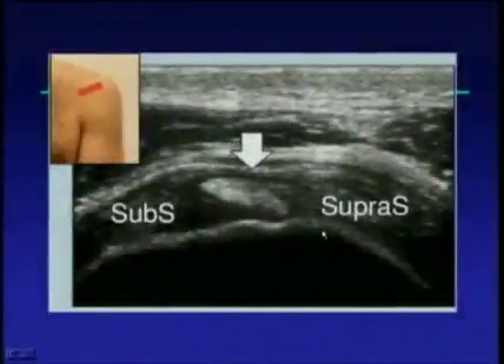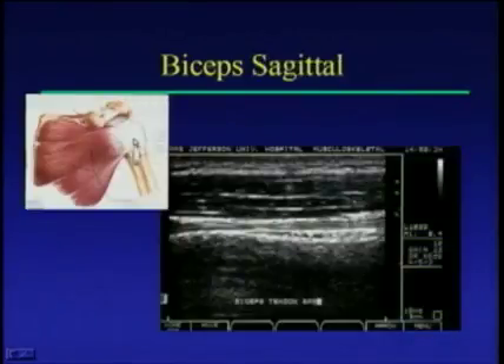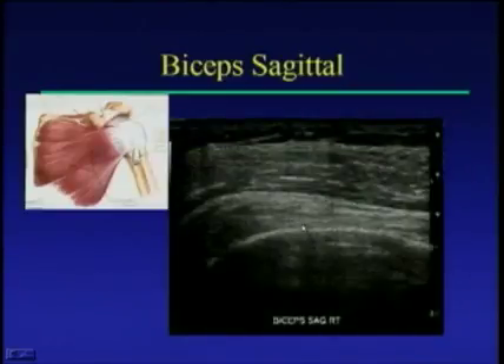Once you finish the transverse view, you want to look at the biceps tendon in long axis. Scanning in long axis, you see the tendon and the groove — the bicipital tendon and the bicipital groove or shaft of the humerus. With newer high-frequency transducers, the tendon anatomy looks much better compared to older transducers.